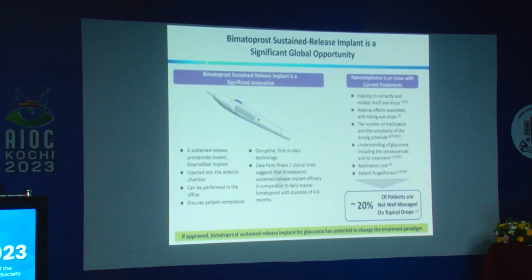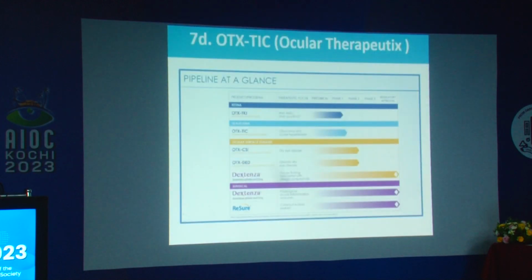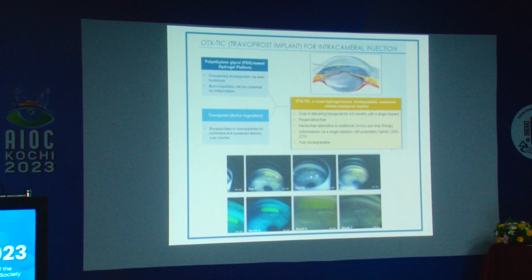A lot of studies have been published showing pretty good results. And like I mentioned before, Ocular Therapeutix, which has the punctal delivery system also, they are coming out with a number of drug delivery systems which are intracameral, be it in ARMD, be it in glaucoma, be it in dry eye, be it in ocular allergy. So basically you implant the pellet, gradually over time the pellet is going to reabsorb because it's a biodegradable implant.